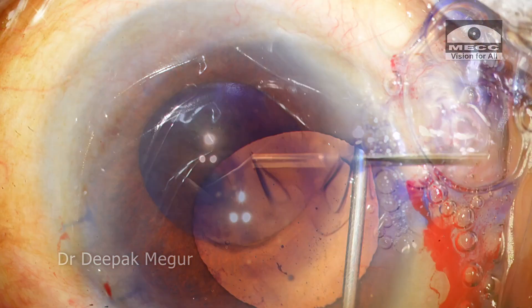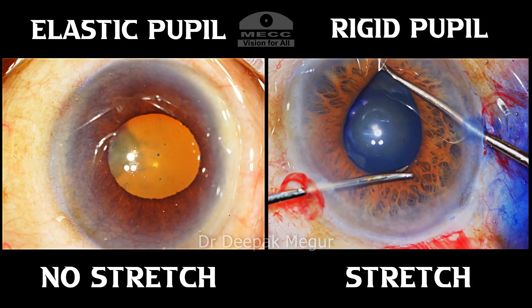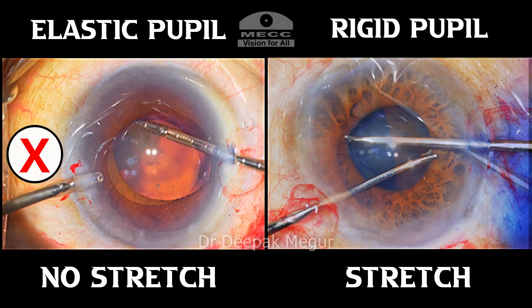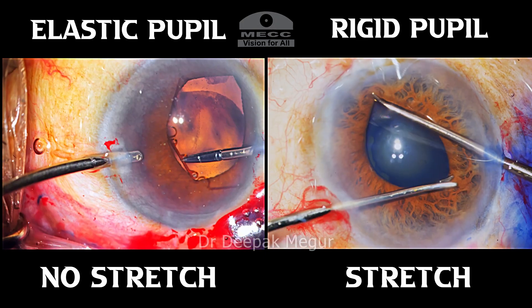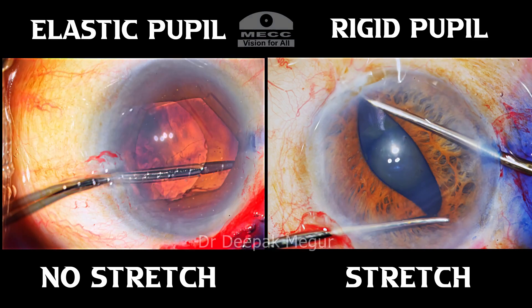Elastic pupils can dilate a little bit with viscomydriasis. These two variants must be differentiated for one simple reason: it helps us to decide whether we can perform stretched pupilloplasty in that particular case. Stretched pupilloplasty is often used to improve intraoperative visualization, with or without a pupil expansion device.